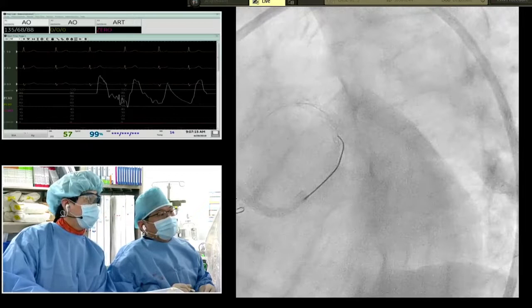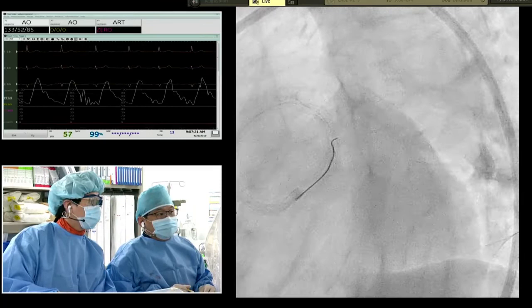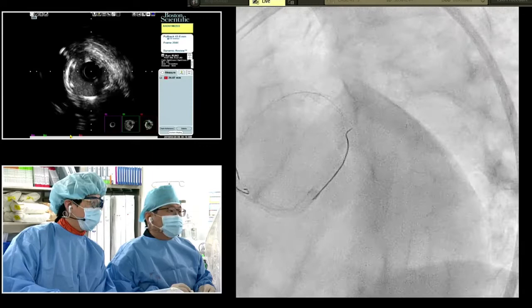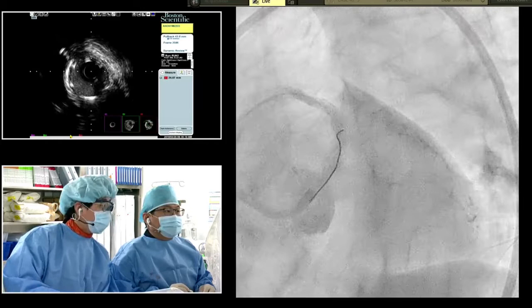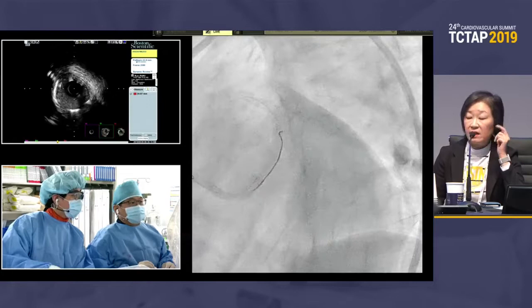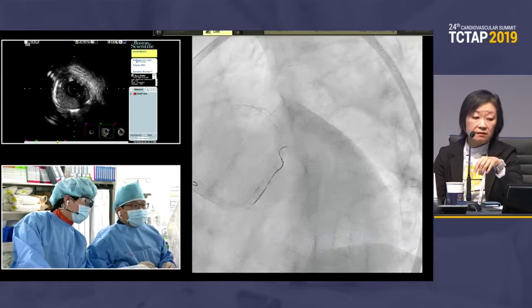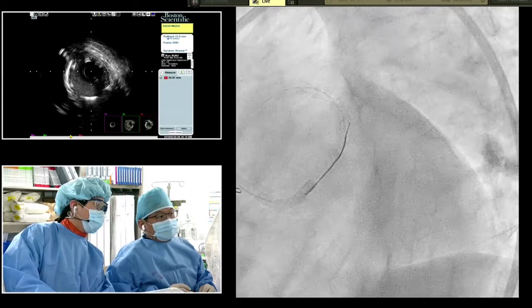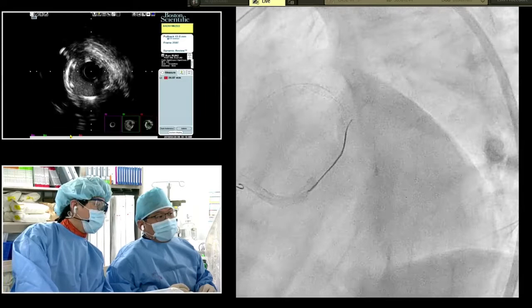Should be a good time to change the wire. In a catheter, we always use a double lumen catheter like a Crusade in this kind of situation, because the angle from left main to circumflex is quite strong. And maybe you can try a reverse wire technique, using a double lumen catheter and trying reverse wire.